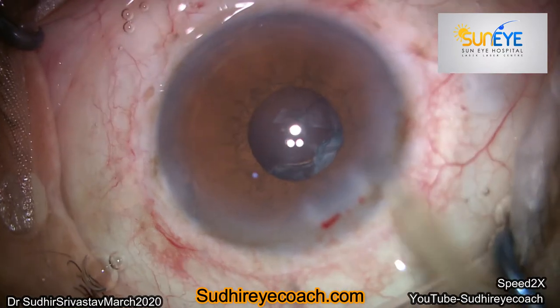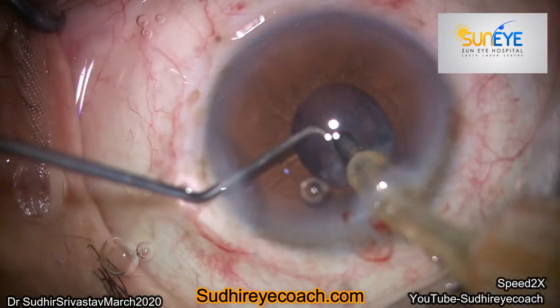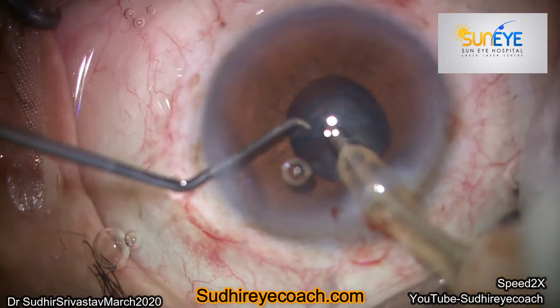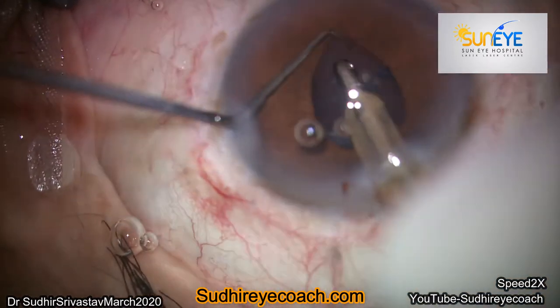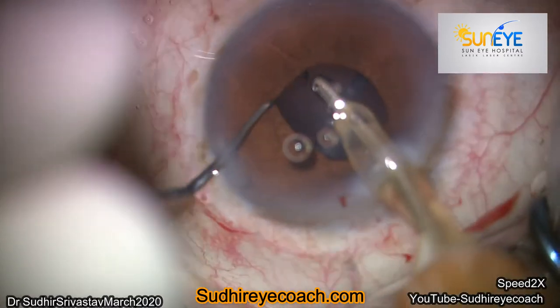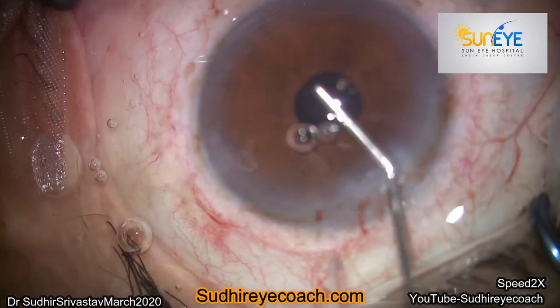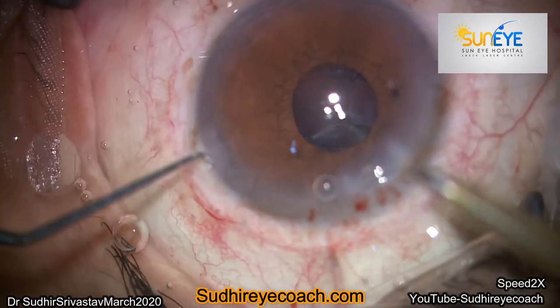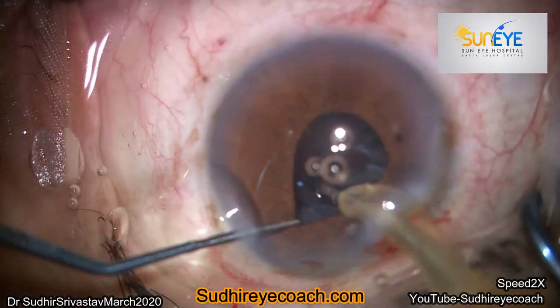Several thoughts came to mind — should I use a pupil expander device? But I continued and thought of using my second hand as support. I mostly use a blunt tip Ziegler hook for manipulation. If you are stretching the pupil with a blunt instrument at one point, there is very little chance of damage to the sphincter.